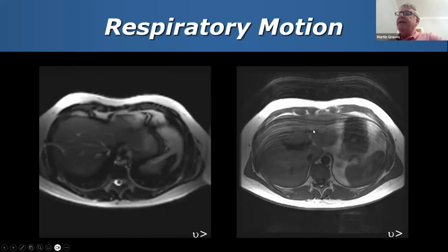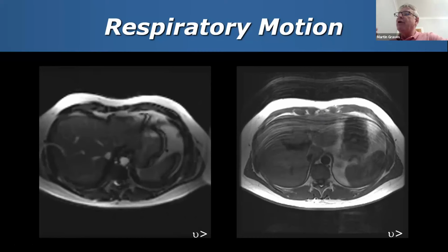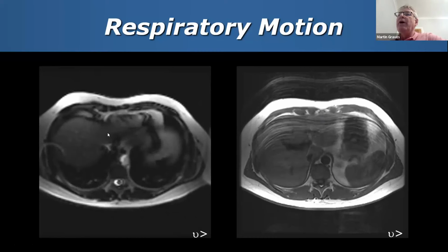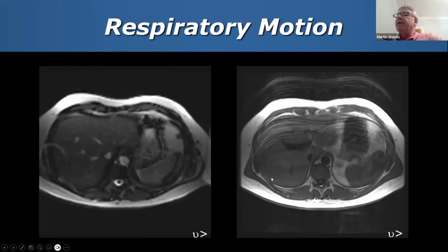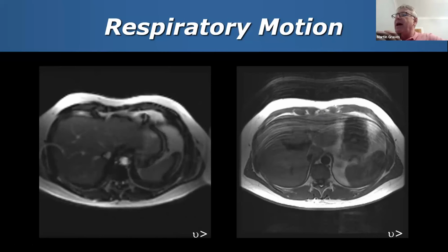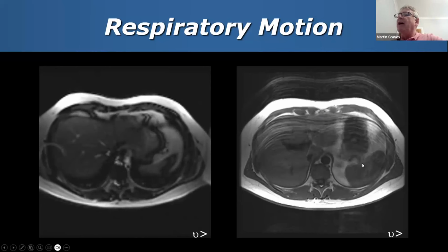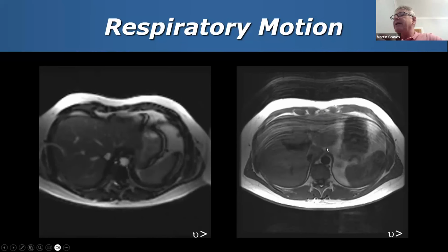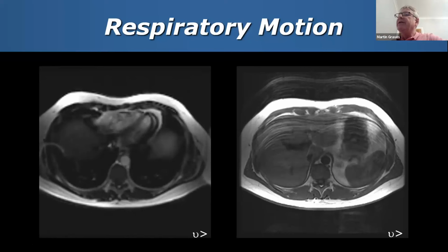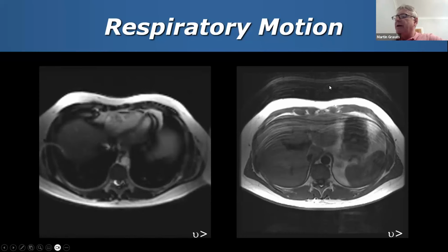And that's because the phase encoding is performed every TR period, and every TR period is much more commensurate with the time interval of structures moving. In the frequency encode direction, we can normally acquire data in a few milliseconds, say 8 milliseconds, something like that. So there's very little time for motion. But if you have a TR that is going at, let's say, 2 seconds, then you know that the organs will be in a different position every 2 seconds. So therefore, after reconstruction, these variations end up as these ghosting artifacts.